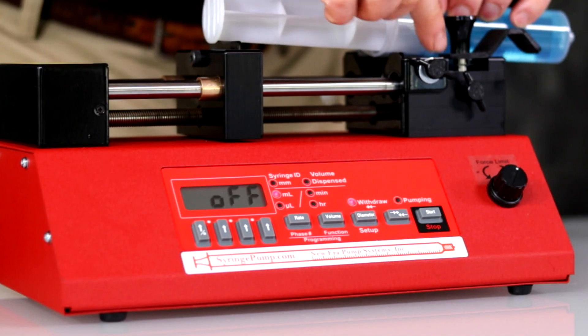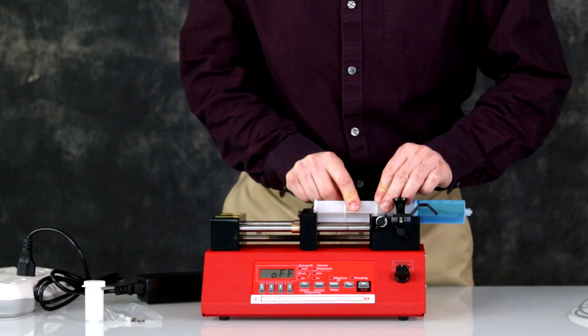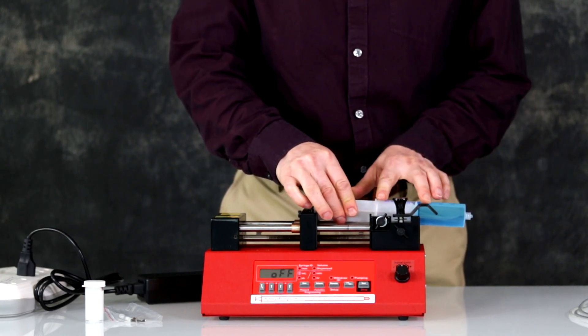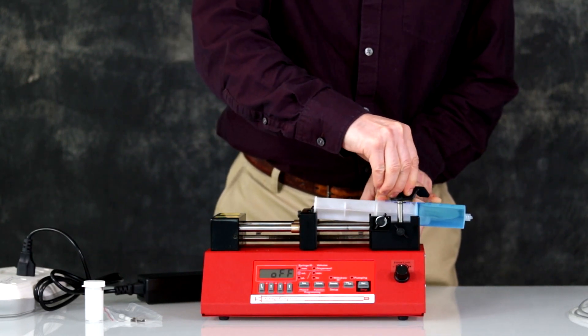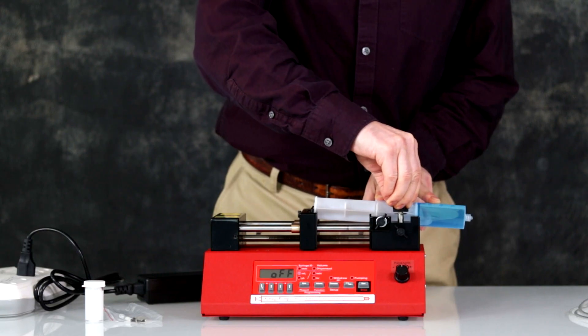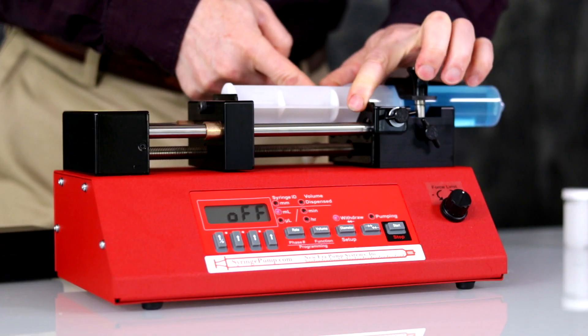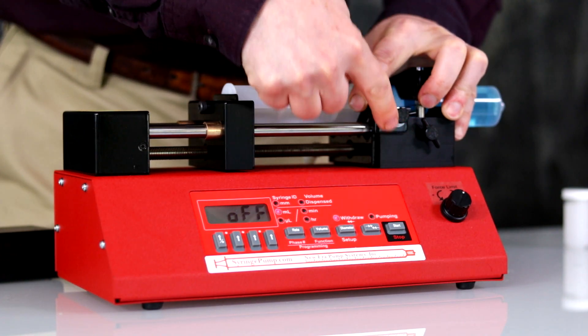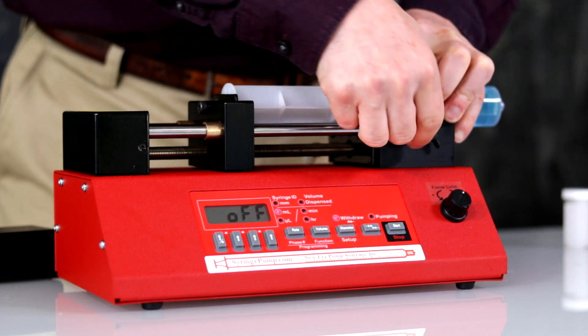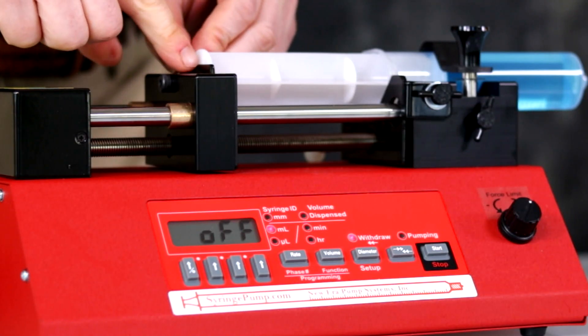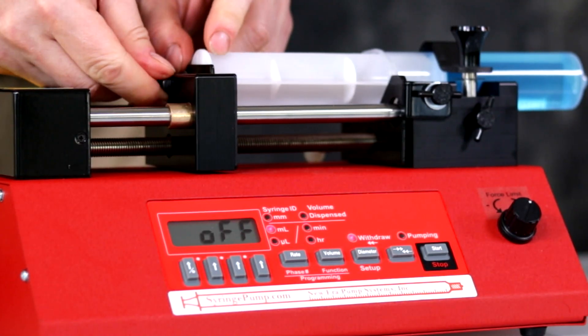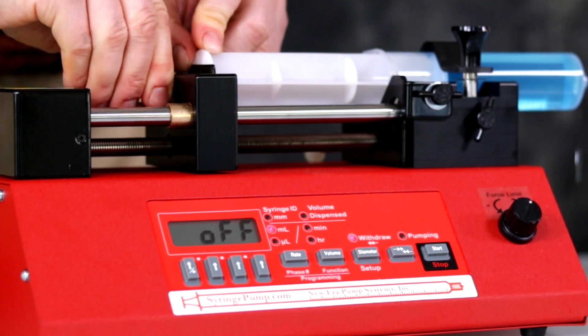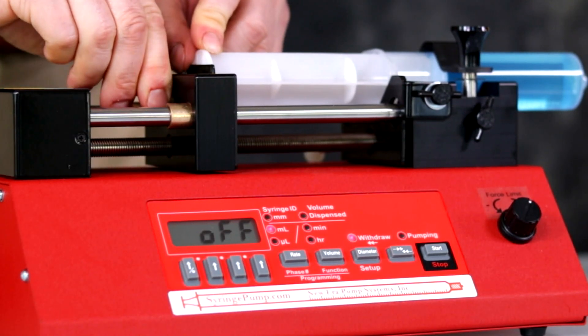Secure the syringe by moving the syringe clamp into place and tighten brackets by turning the two thumb screws. Make sure that the anti-siphon bracket is secure by turning the screw counterclockwise. Now the syringe is ready.